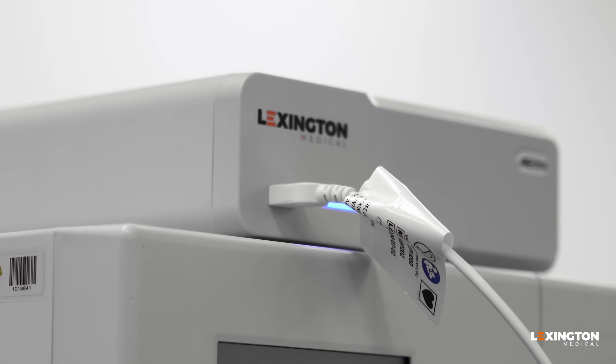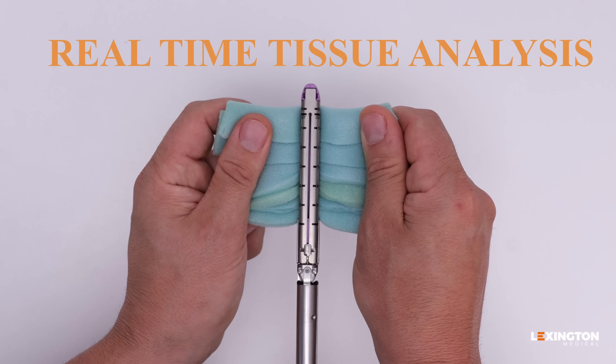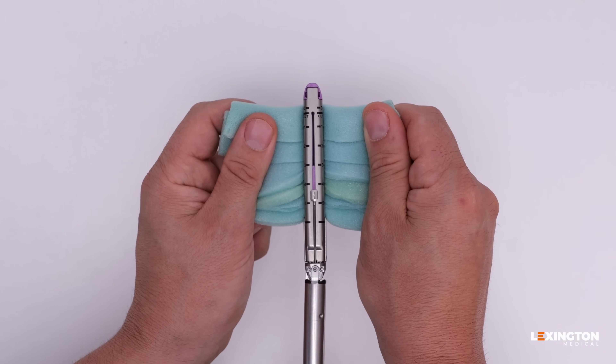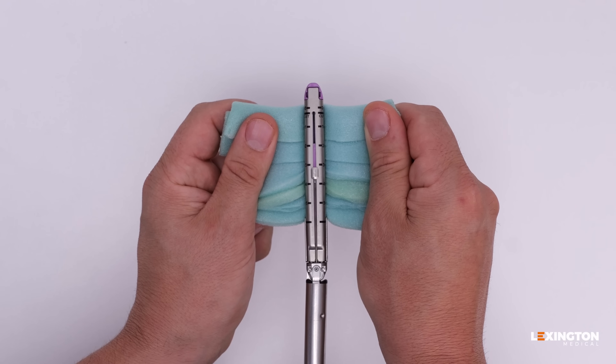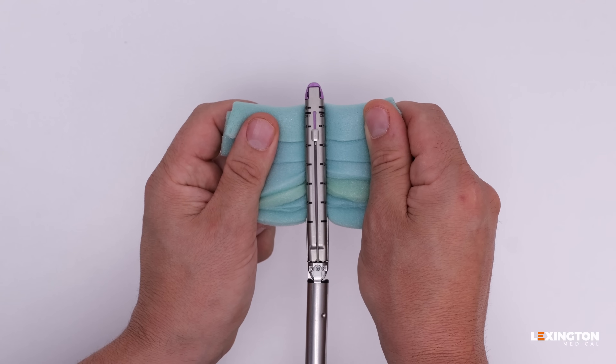Aeon delivers unmatched control, performance, and safety. With real-time tissue analysis, it reads resistance 1,000 times per second, adjusting the firing speed via seven speeds based on tissue thickness to ensure optimal staple lines, even in the most complex and challenging tissues.